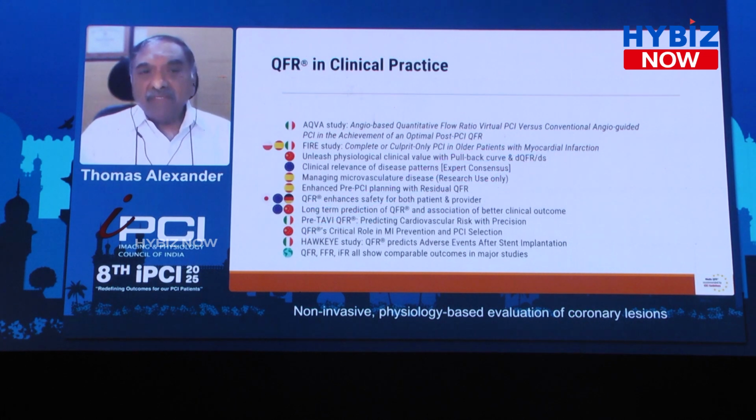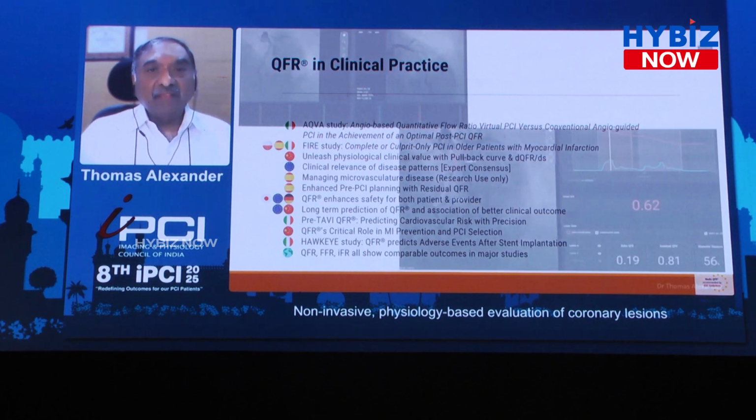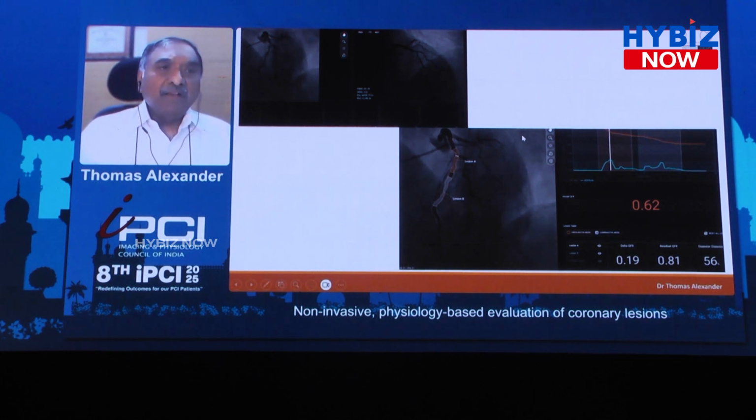There have been multiple studies which have looked at QFR in various clinical situations. I won't go into them in detail, but I can tell you that this is almost as much data as has been produced for FFR. So this is what a typical case looks like.